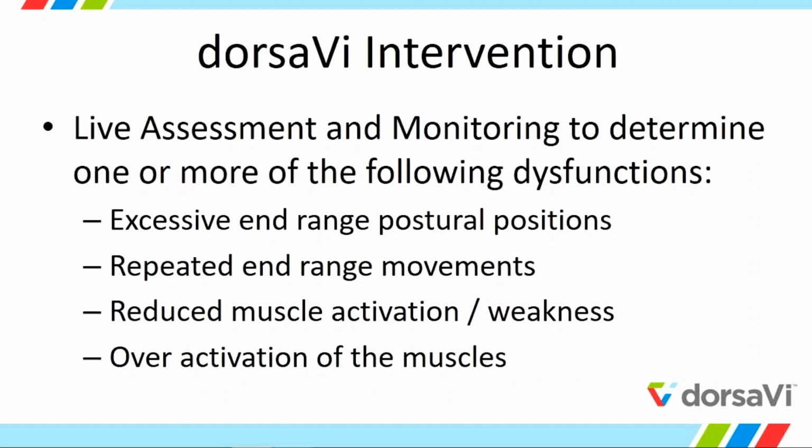Was that happening? Were they repeatedly at the end range of the movement? Did they have reduced muscle activation and/or weakness? They used EMG with the monitoring, or did they have overactivation of the muscles? So having determined all of that, then they would determine how they were going to treat them using the V-Move.